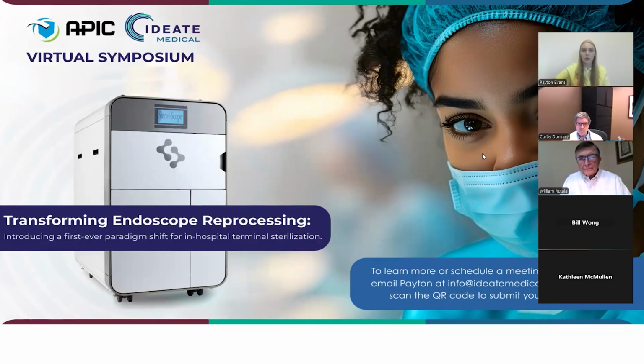Steve had a question. What is the BI read time, and is it once a day or per load? I think I can take that one. It depends on the policy of the hospital. It can be once a day for each system or per load.